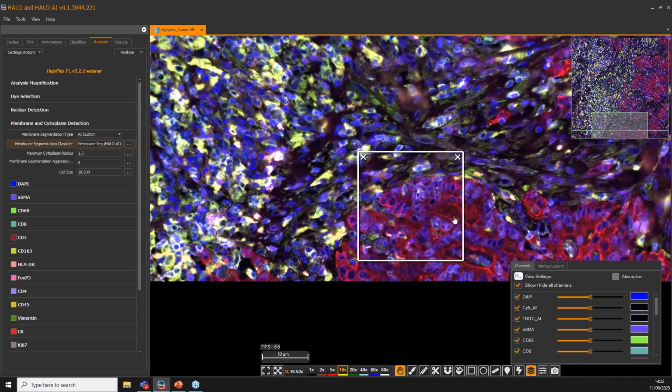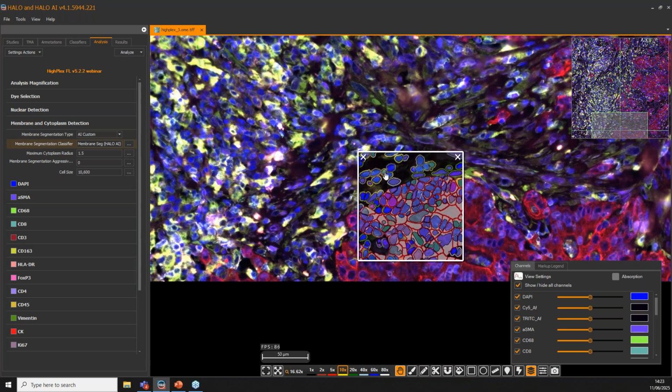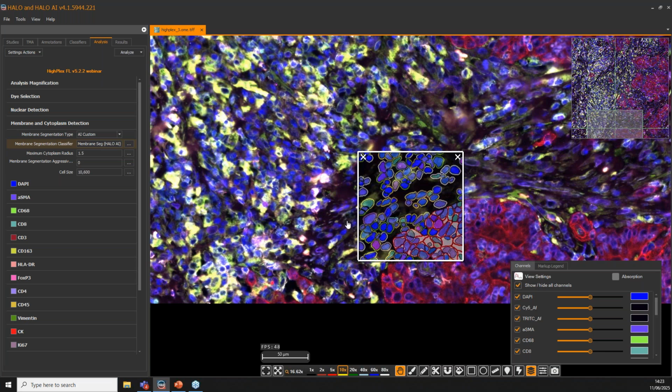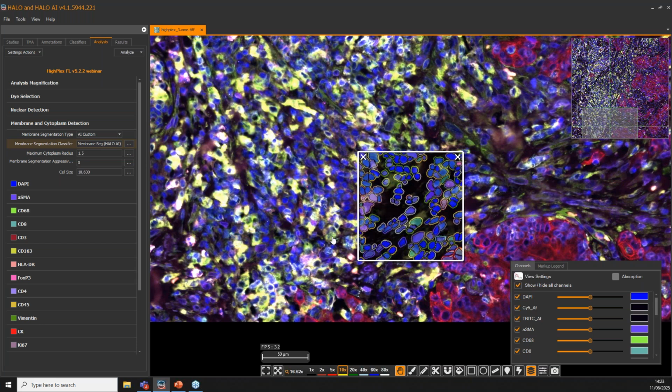It was too shy. So here you see that instead of having a round shape, we do actually have the membrane being depicted here. All right, so we have actually gone forward a bit too much in the sense that those have already been thresholded, but I can show you how to do this right now.